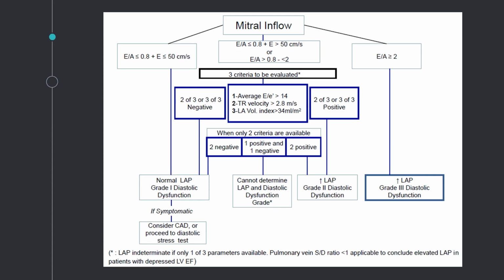Yeah. So I guess two comments. One is that I think you're going to have some patients where you're going to end up calling grade 1 diastolic dysfunction, and it probably doesn't make a huge difference clinically, because grade 1 just means that there's impaired relaxation, but no increase in filling pressures. So the difference between grade 1 and normal diastolic function really is somewhat arbitrary, right? Yep. But then you're labeling them with some degree of abnormality, which was the major controversy before, where you'd have an 89-year-old patient with grade 1 diastolic dysfunction, impaired relaxation, and whether that is the normal aging process versus something pathological. I think that's the challenge. So I don't do that. I don't put it into the second algorithm, but I can see why others would be doing that.